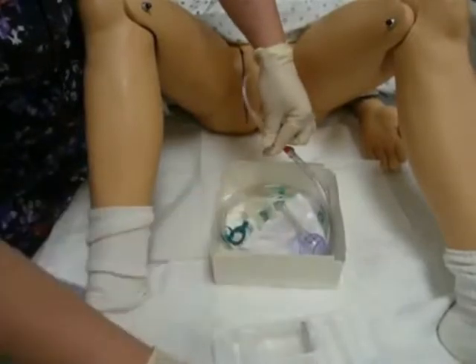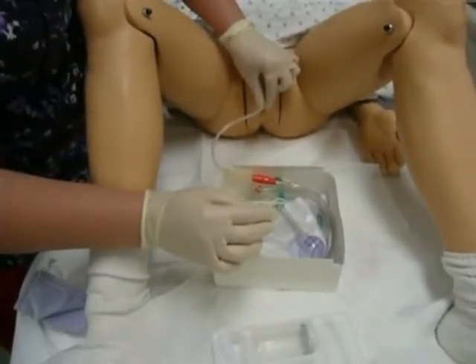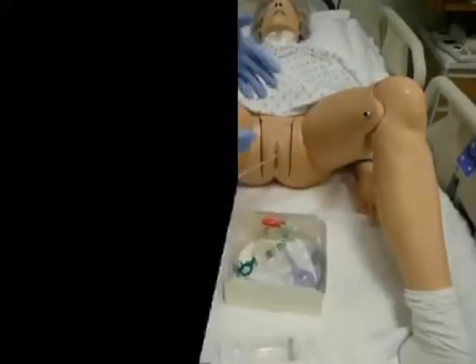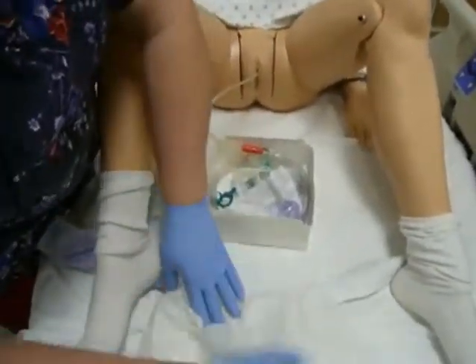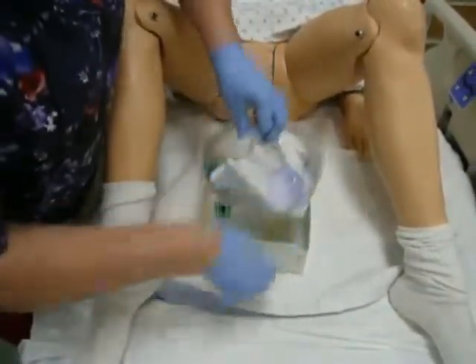All the way — all ten cc's. Once that balloon is inflated, I can bring my fingers off here, disconnect there, and put that down. You gently tug back to make sure the catheter is in the bladder neck. Now I'm going to transition from my sterile gloves to clean gloves. Now that I have my clean gloves on, I'm going to clean up my garbage, fold that up, and throw it in my waste paper bag.